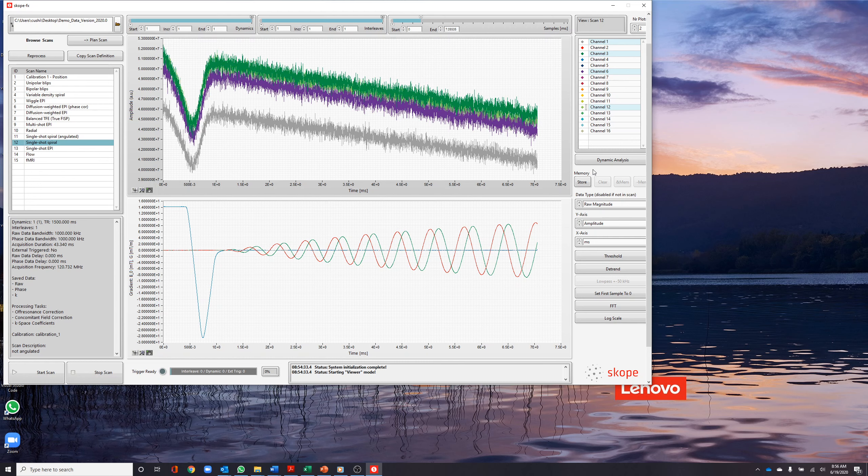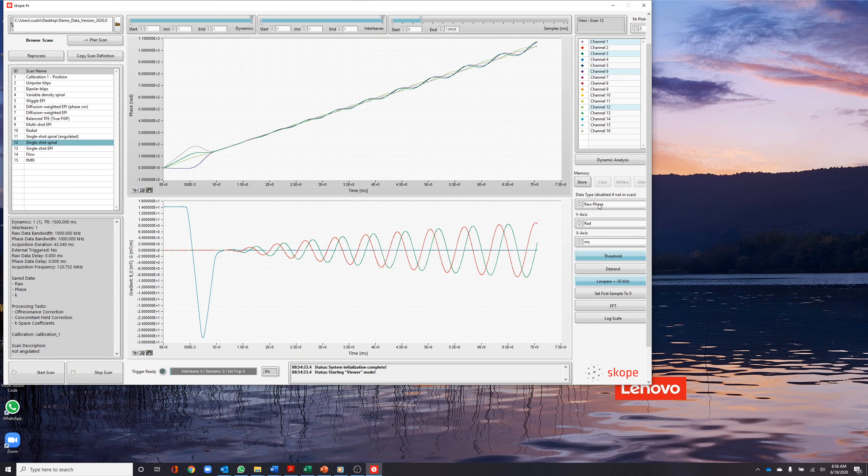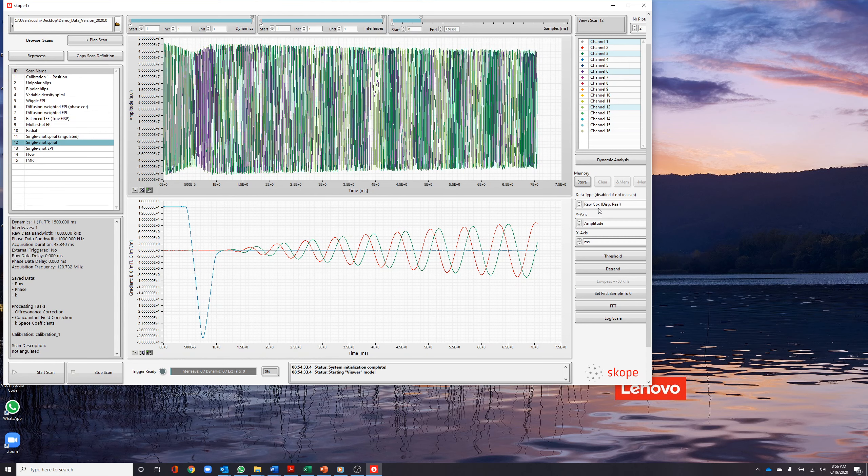Similarly, the raw phase and complex data can be visualized. Visualizing raw data is helpful when trying to investigate probe behavior or ensuring adequate probe signal.